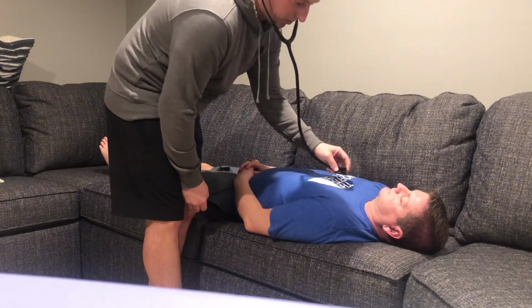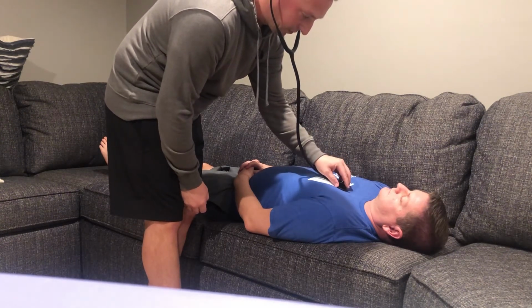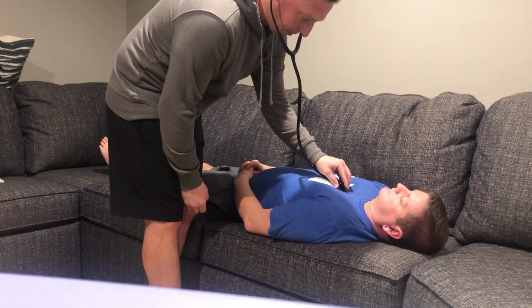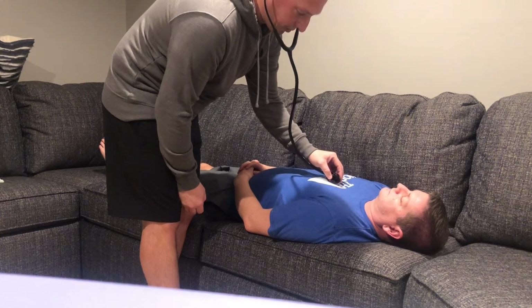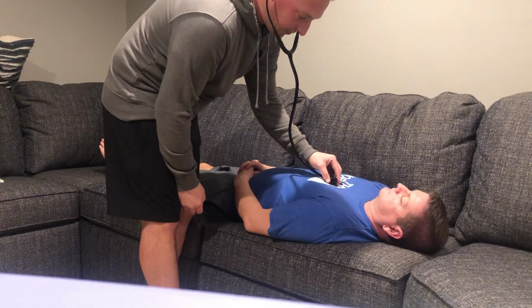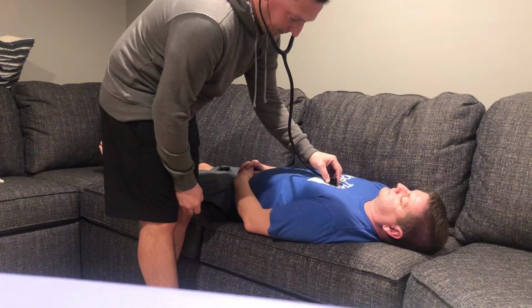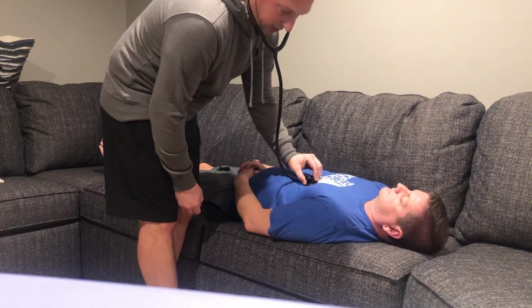We'll then move over to auscultate the pulmonic valve, which is the second intercostal space, left sternal border. We'll move down to the fourth intercostal space, left sternal border, to auscultate the tricuspid valve. And finally, we'll move down to the fifth intercostal space, left midclavicular line, to auscultate the mitral valve.